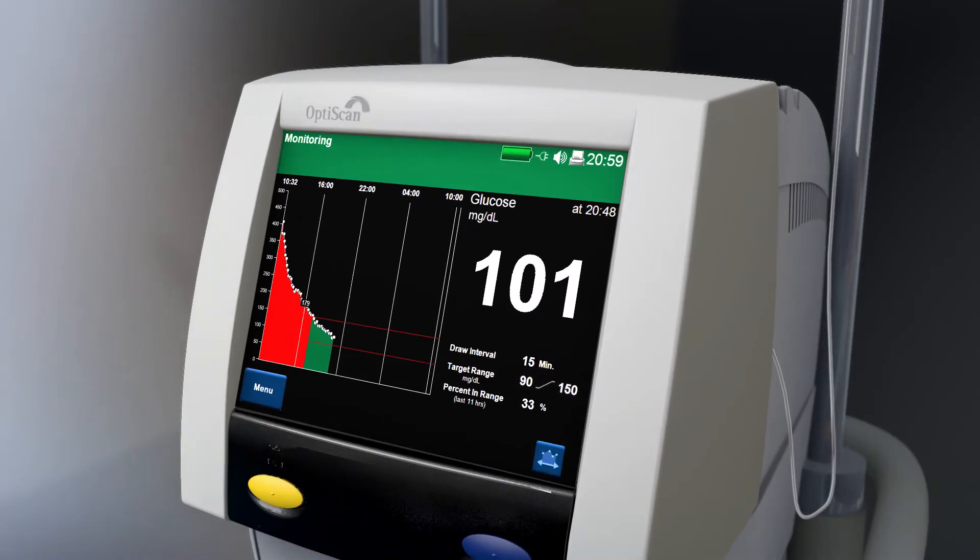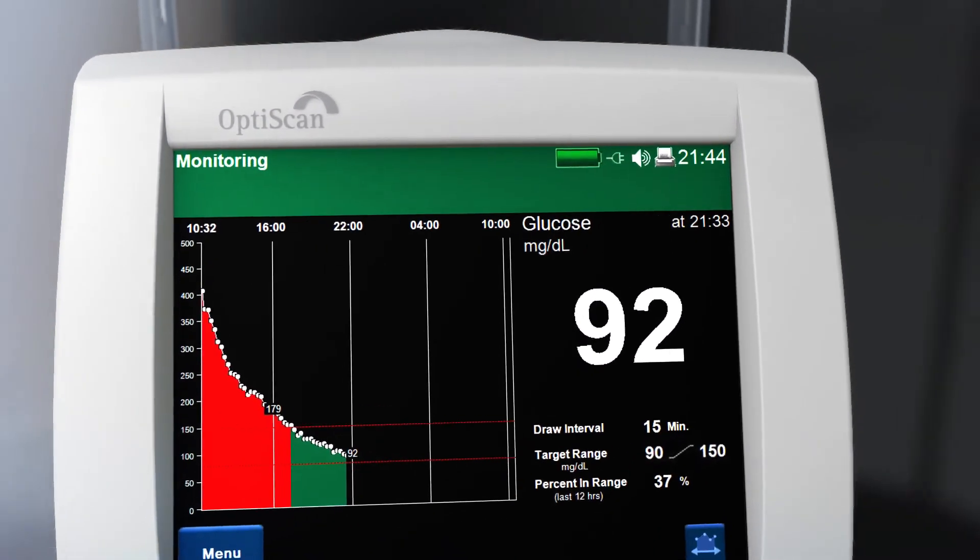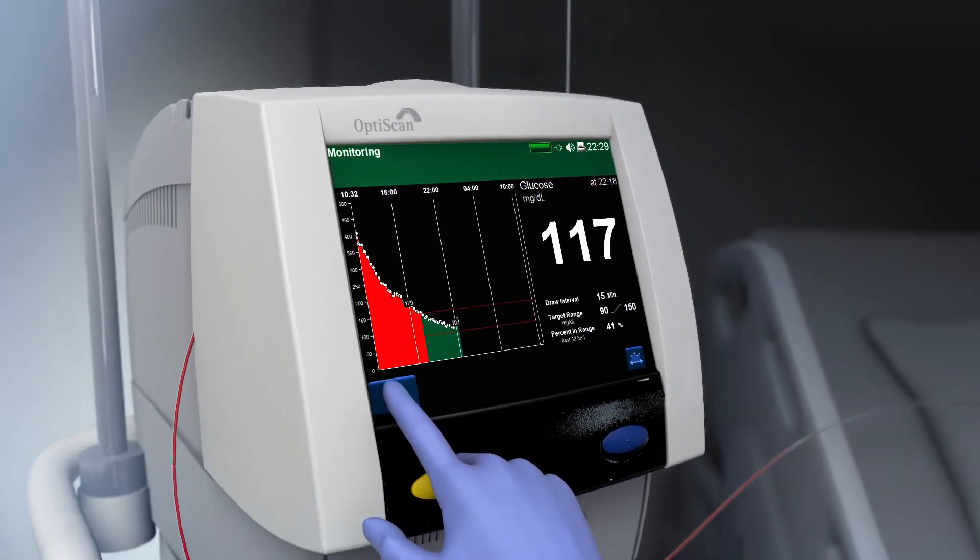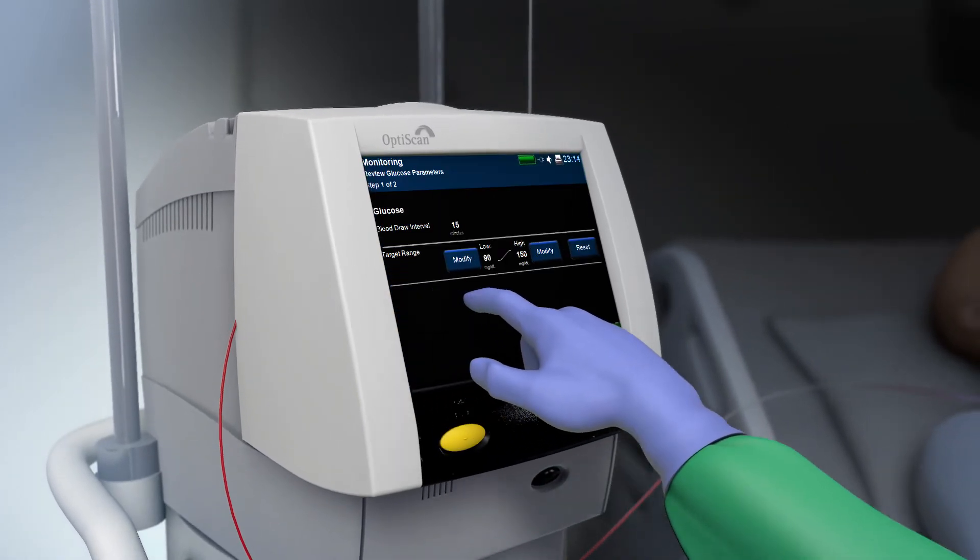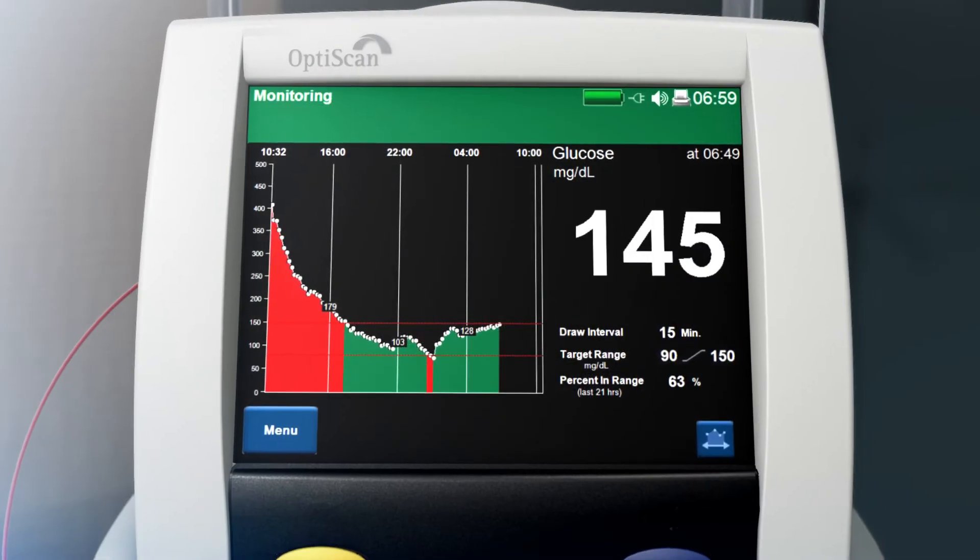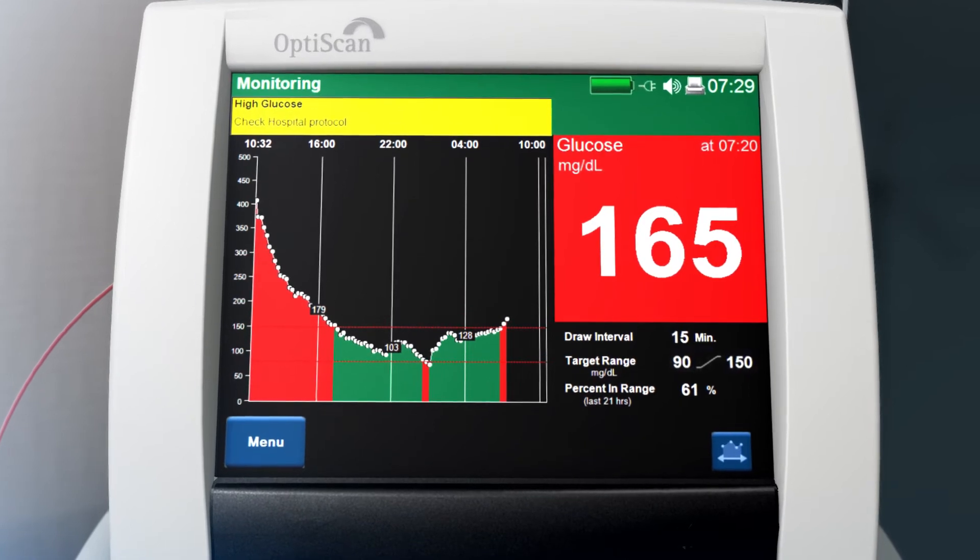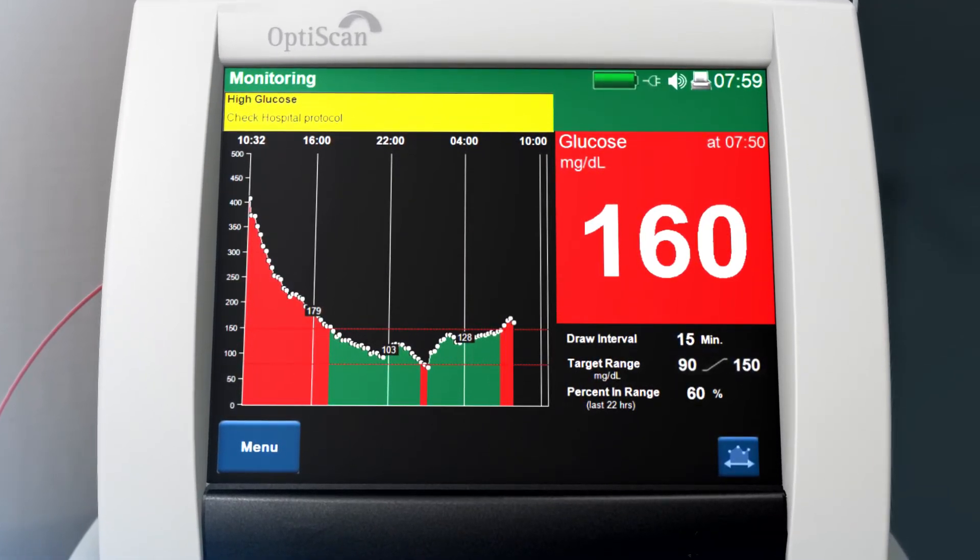Glucose results are displayed on the screen, along with a trending graph of the glucose values. The clinician can customize the target range according to hospital protocol and patient's condition. If the glucose levels move outside of the desired range, the OptiScanner alerts the clinician by displaying a glucose value against a red background.